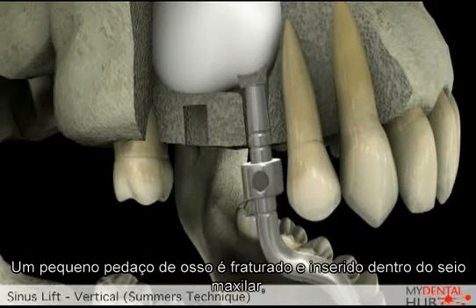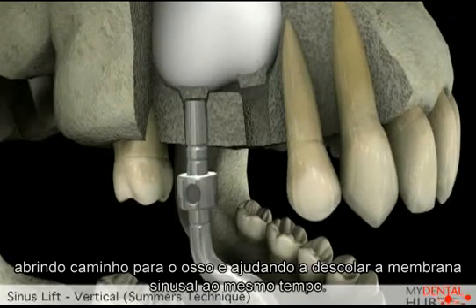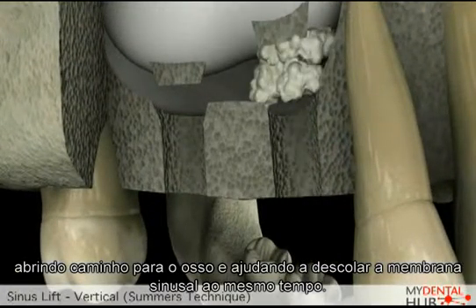A small piece of bone is left under the sinus. Once the bone has been prepared, we then use an instrument to release the small piece of remaining bone, which lifts the sinus membrane at the same time.